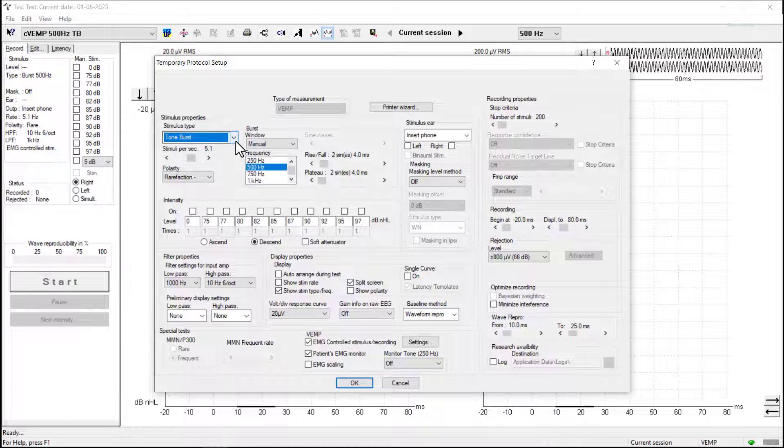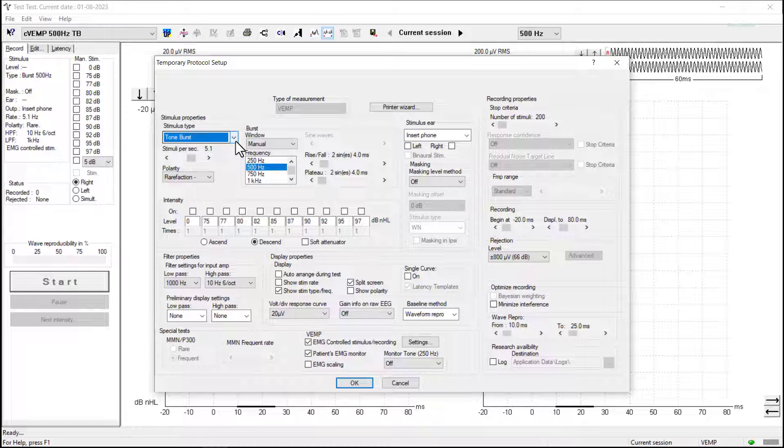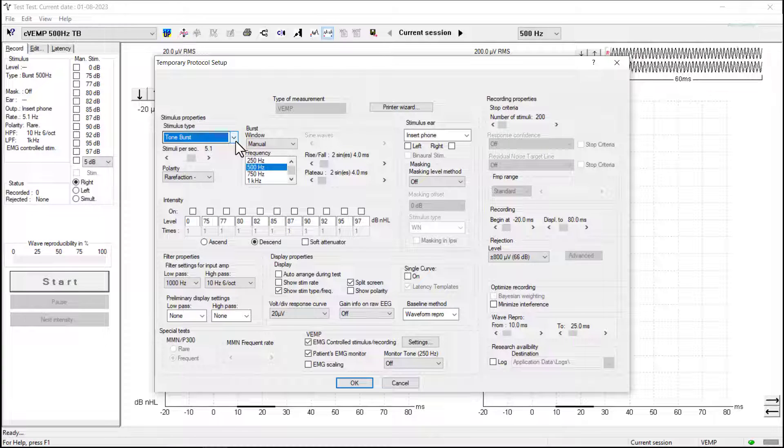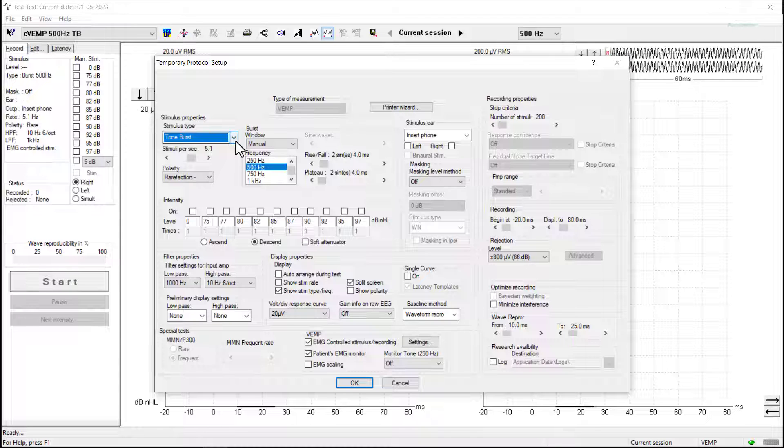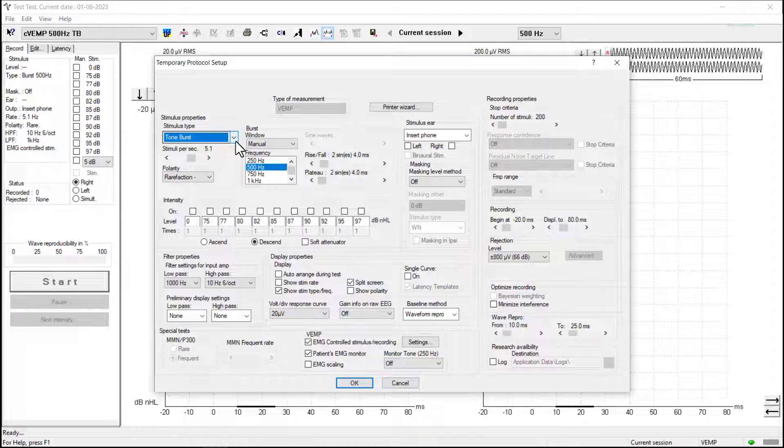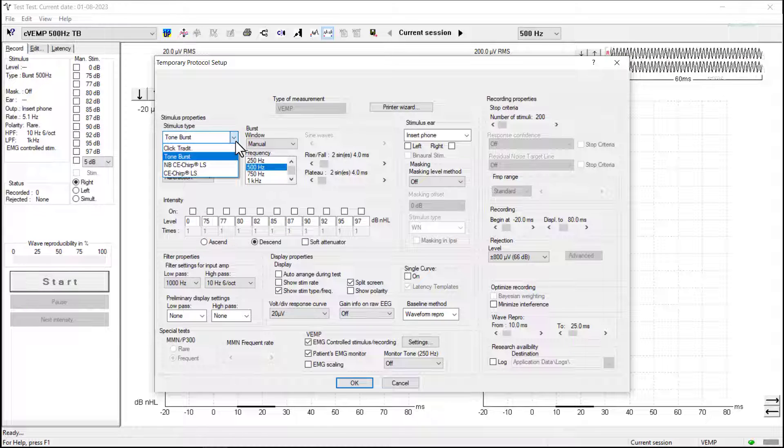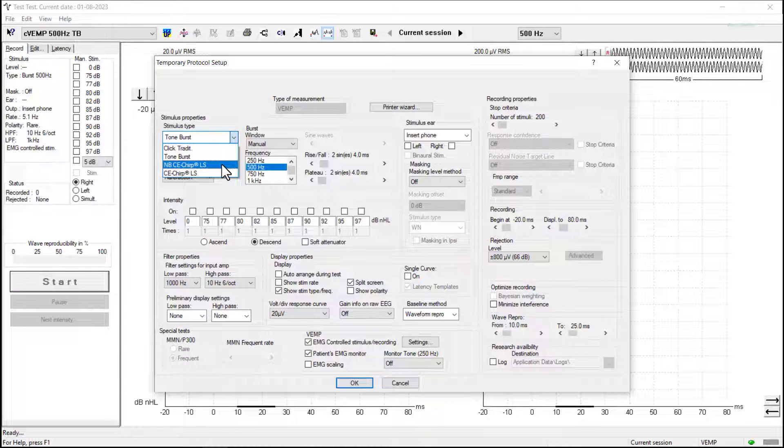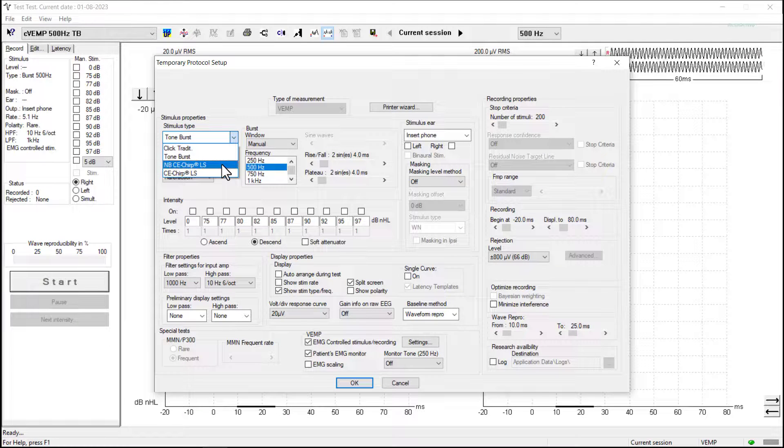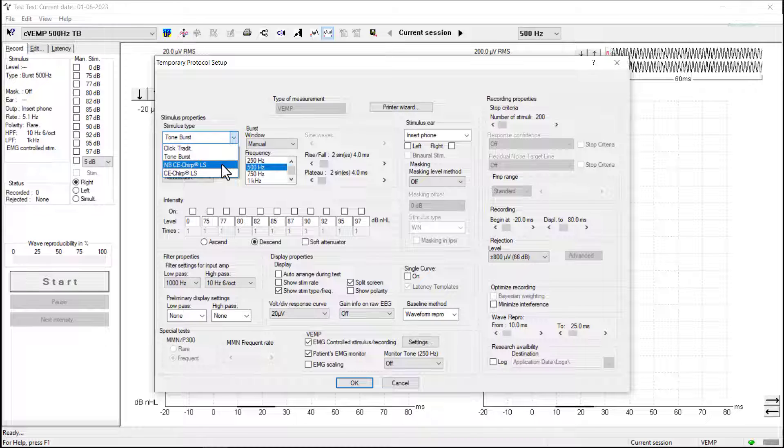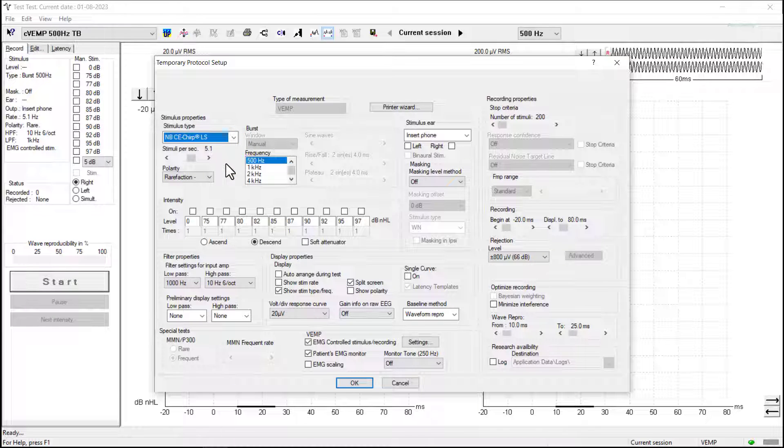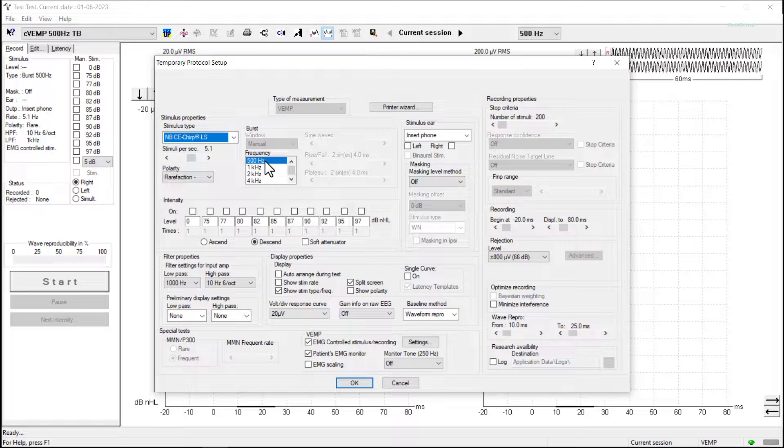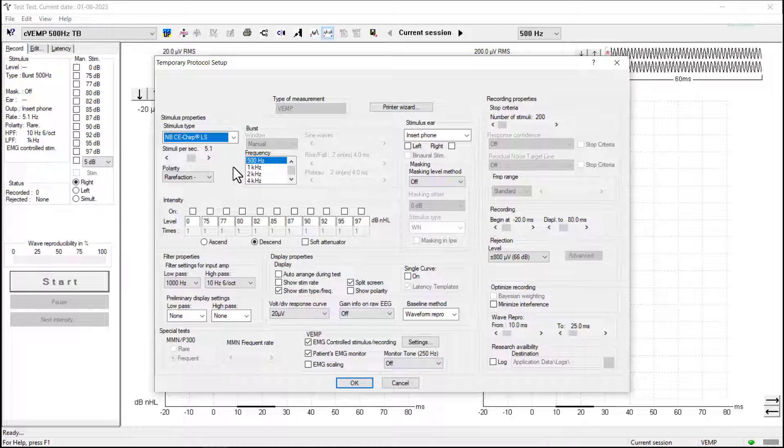The C-VEMP protocol defaults to using a tone burst stimulus, but a recent paper published in 2023 did a comparison between different stimuli types and found that the narrowband C-E Chirp stimulus family actually provided larger response amplitudes. So today I'm going to select the narrowband C-E Chirp 500Hz stimulus.